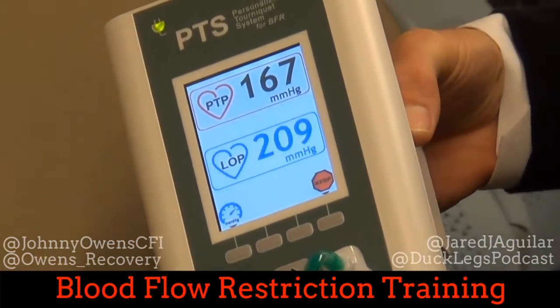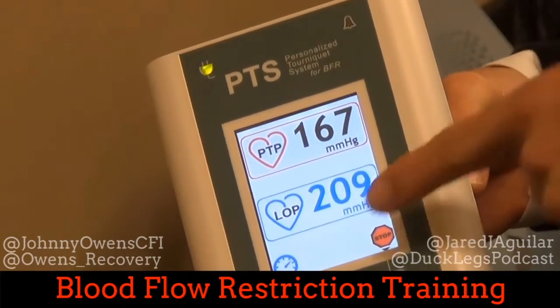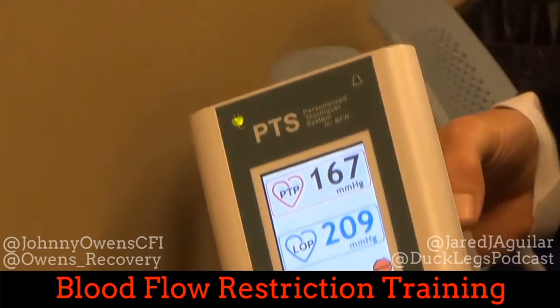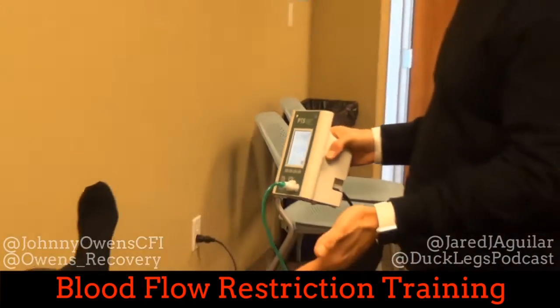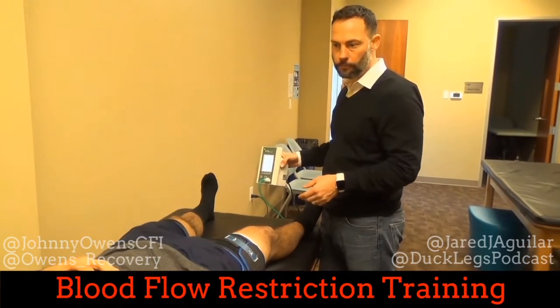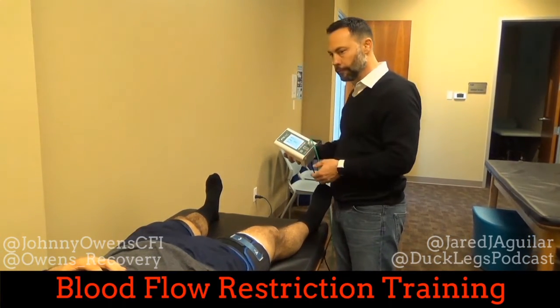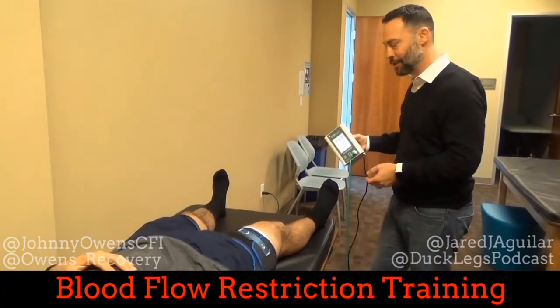The term for that full stoppage is LOP — limb occlusion pressure. 80% of that is what we target for the lower extremity, and 80% of 209 would be 167 millimeters of mercury. So we're going to allow 20% arterial flow to go in, but we're going to block pretty much all venous return while you exercise.